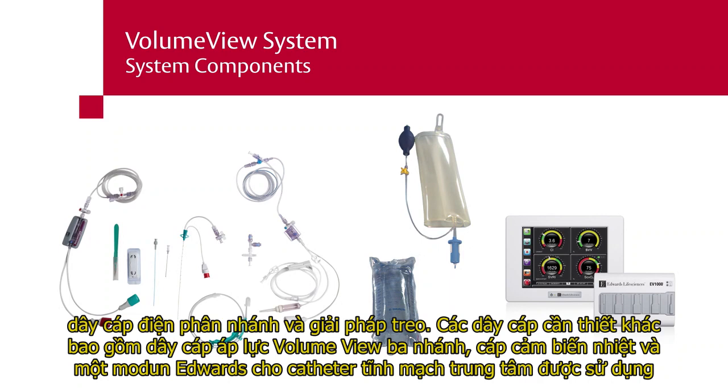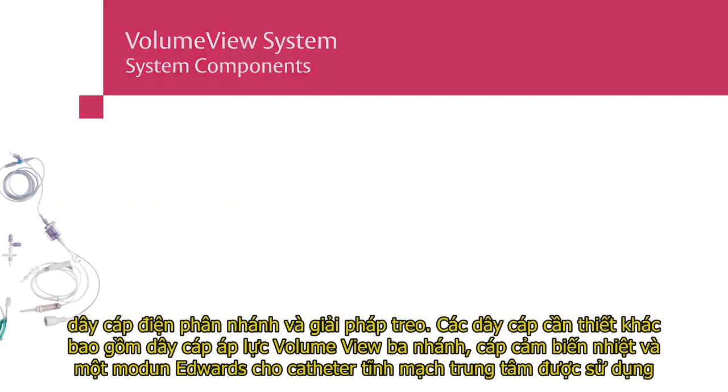Other necessary cables including a VolumeView trifurcated pressure cable, a thermistor cable, and an OM module if Edwards oximetry central venous catheter is being used.